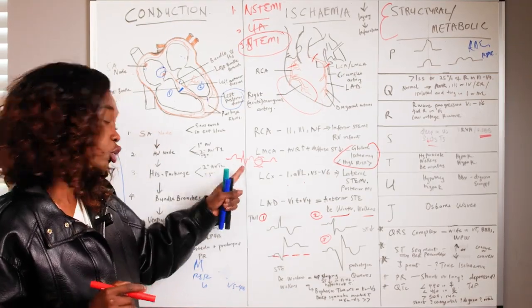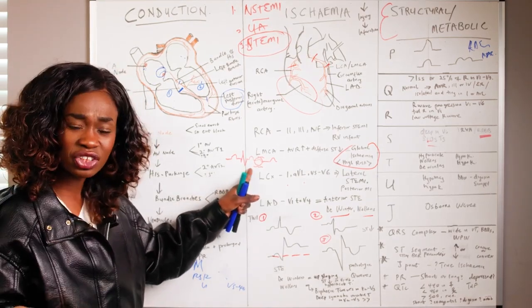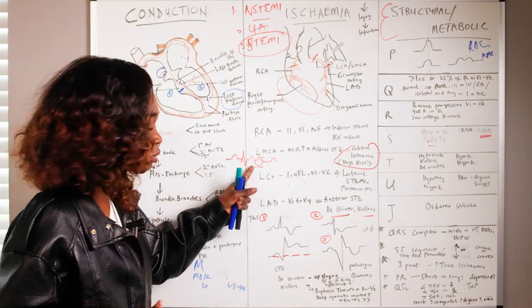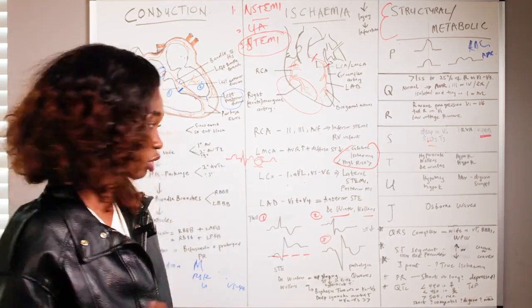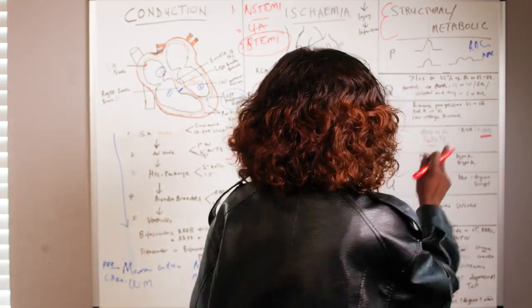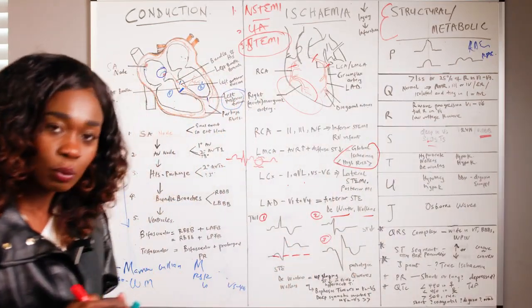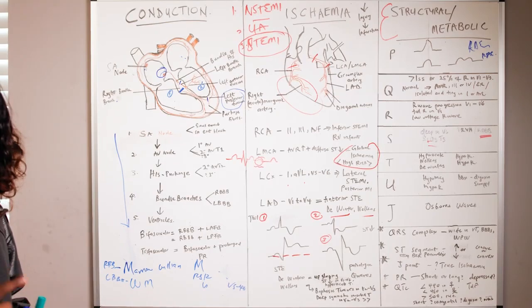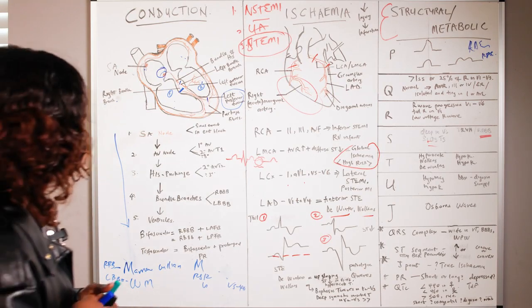I've seen a patient with a potassium level of 2.9 that presented with this ECG. Because ECG is one of our triage tools, you may be able to pick it up first on the ECG before you pick it up on the bloods, before your blood results come back. So, you can find it in hypokalemia, you can find it in hypomagnesemia. Also, don't forget your scooped segment, which can also look like a U wave, which occurs with digoxin use, right?